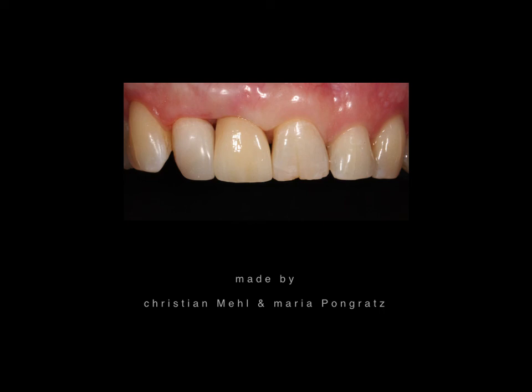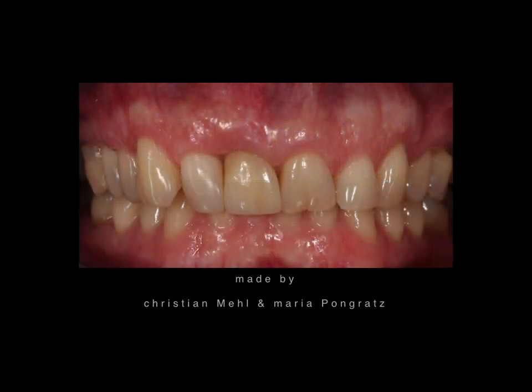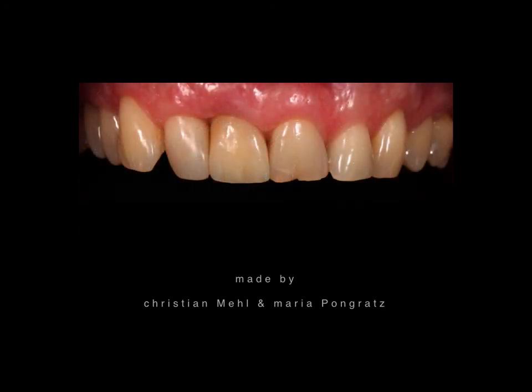And then the cemented crown and the picture directly after placement, and in this case half a year later in the recall session, and then 1 year later, and we can see that we have lost some of the tissue height buccally and distally where the inflammation has been, but overall a stable situation, and the patient is happy with that.